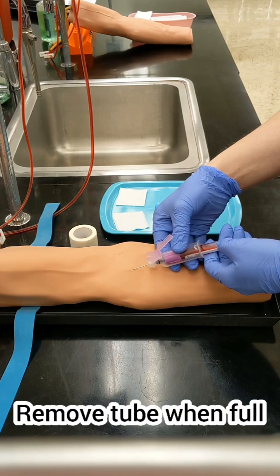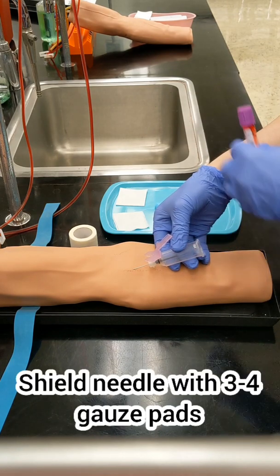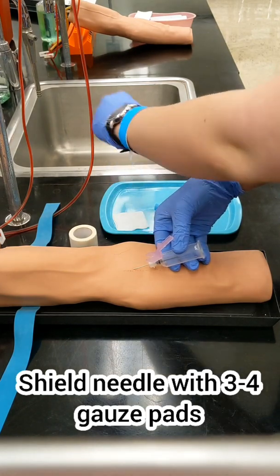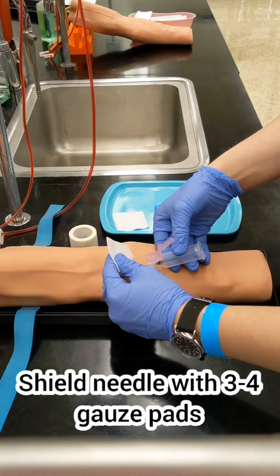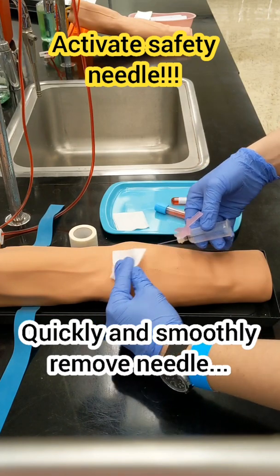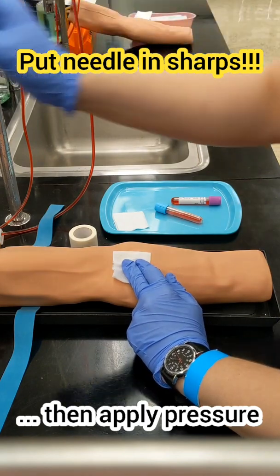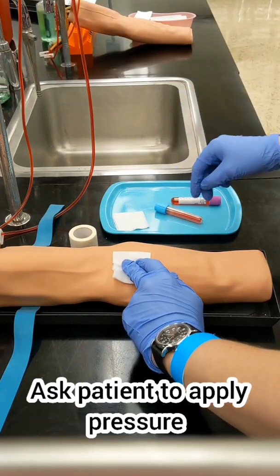Once you've removed the last tube, grab your thick pad of gauze that you have waiting. Don't press down on the needle — take that gauze and place it above the needle, and then pull out your needle smoothly. Once that needle is out, then you can go ahead and apply pressure. Ask your patient to apply pressure for you while you go ahead and prep the tubes.